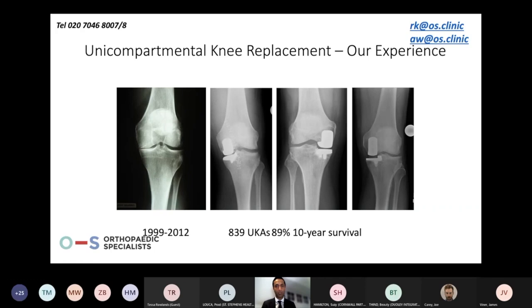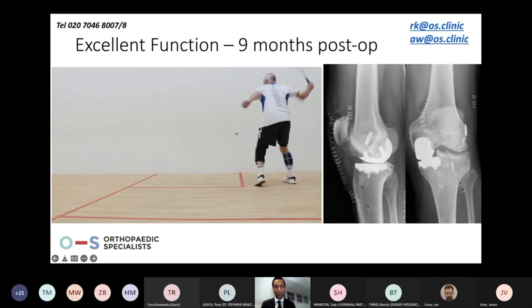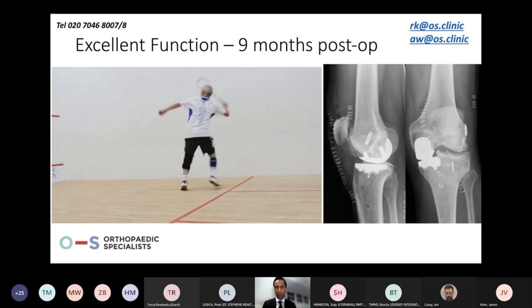This particular patient, because he was deficient of an ACL, we did a combined ACL reconstruction with a partial knee replacement. And you can see patients love sending us their videos. And particularly when they're able to get back into this level of sport. And I'm sure you would all agree, we'd be delighted if our patients were able to get back into this.